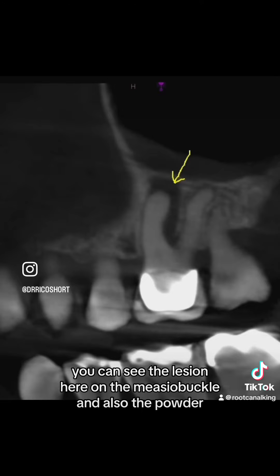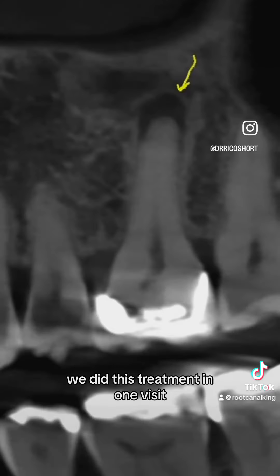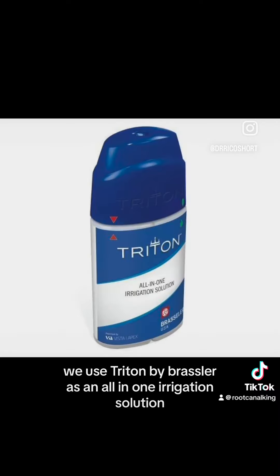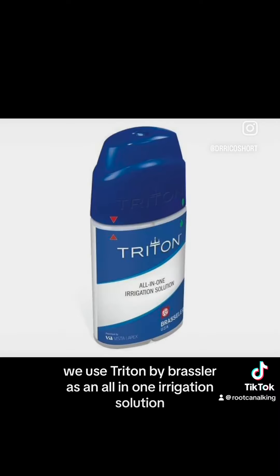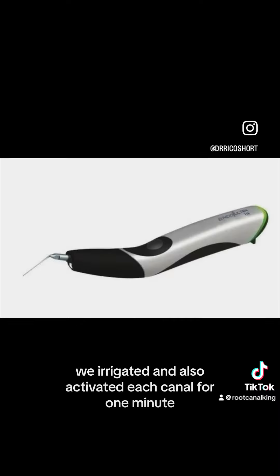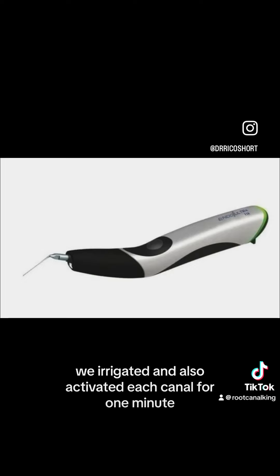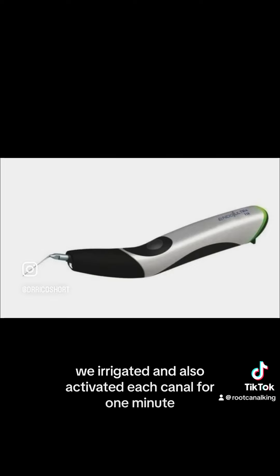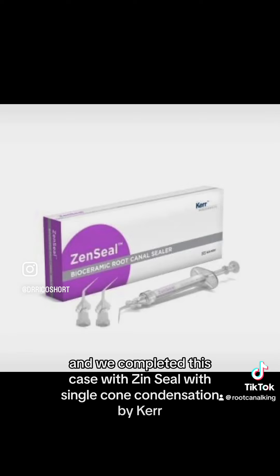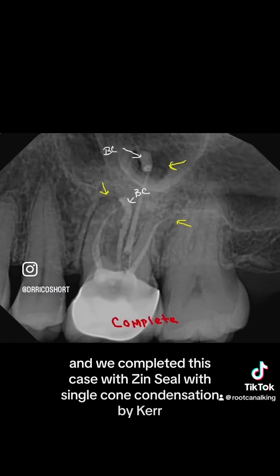You can see the lesion here on the mesial buccal and also the palatal. We did this treatment in one visit. We used Triton by Brasseler as an all-in-one irrigation solution. We irrigated and also activated each canal for one minute, and completed this case with Zen Seal with single cone condensation by Kerr.